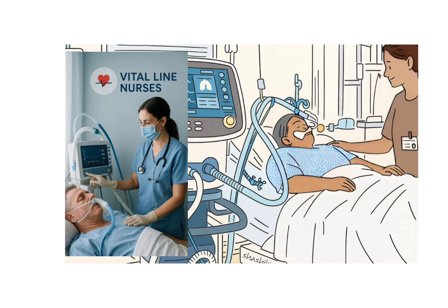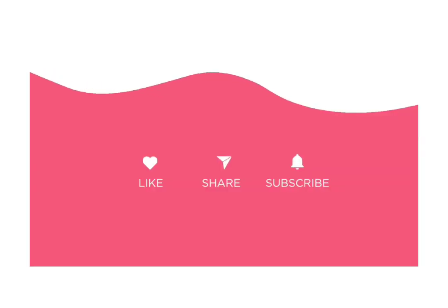5. Respond to alarms promptly. Never ignore an alarm. Assess the patient immediately, then the machine. Your quick response can save a life. 6. Document everything clearly. Remember, your skills and vigilance at the bedside make all the difference. Be proud of the care you give. Ventilator patients need your eyes, hands, and heart.